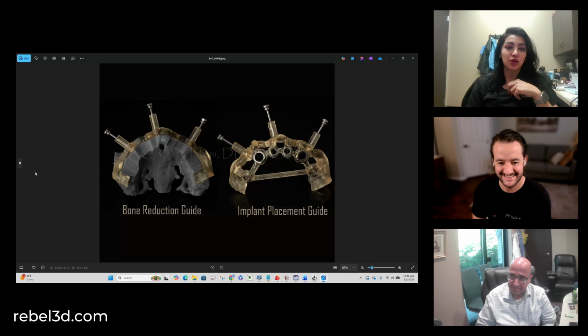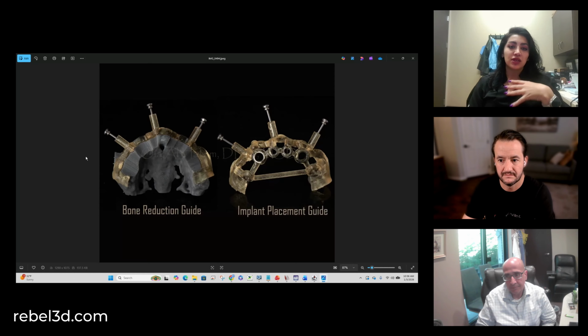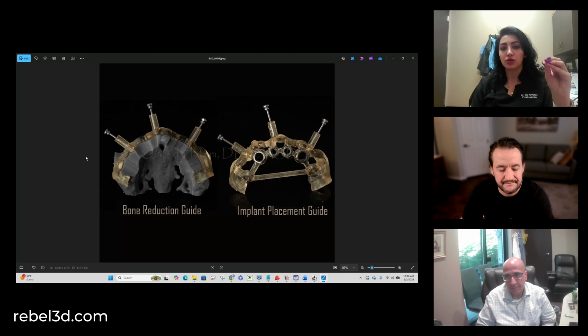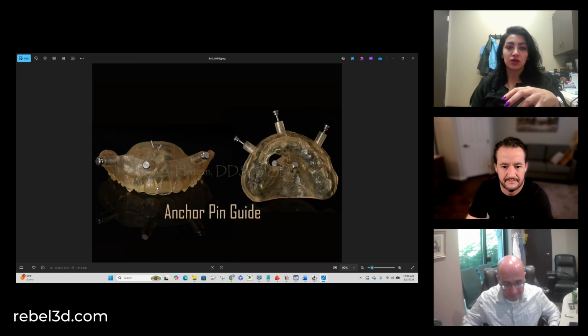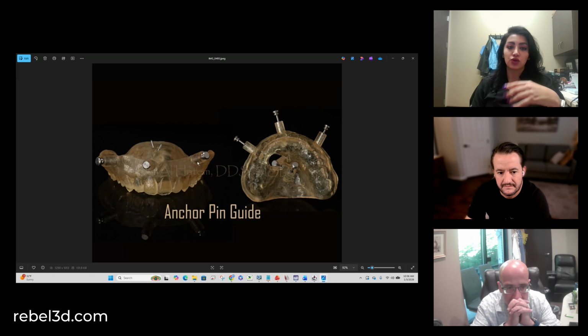As we know with static surgical guides, when it comes to full arches, really the plan is to use a series of guides that will help you get a predictable outcome. So starting from your anchor pin guide, this is coming from a dual scan protocol from a denture that the patient has or you made them, with some fiducial markers.